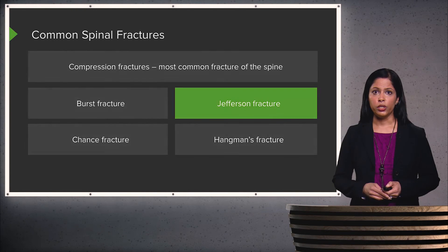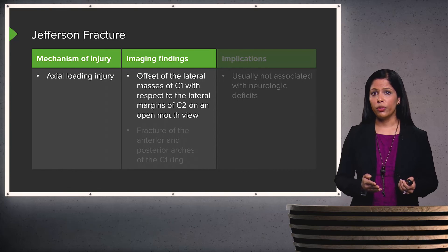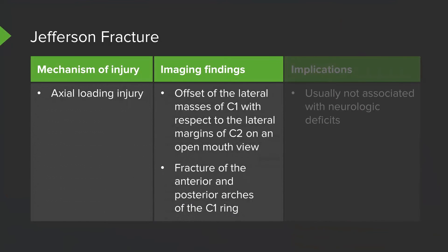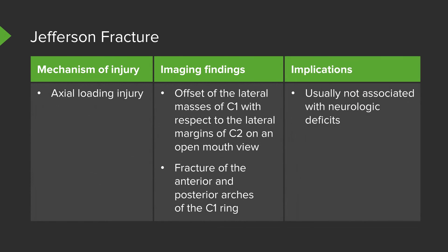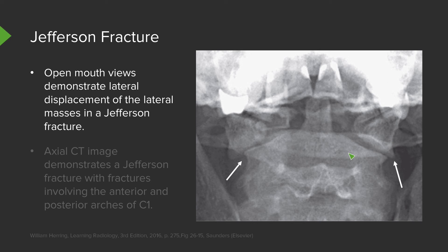Jefferson fractures are axial loading injuries. There is offset of the lateral masses of C1 with respect to the lateral margins of C2 on an open mouth radiograph of the cervical spine. There are also fractures of the anterior and posterior arches of the C1 ring, best seen on CT scan. Usually these are not associated with neurological deficits. This open mouth view demonstrates lateral displacement of the lateral masses, which is prominent when compared with the lateral margins of the C2 vertebral body.